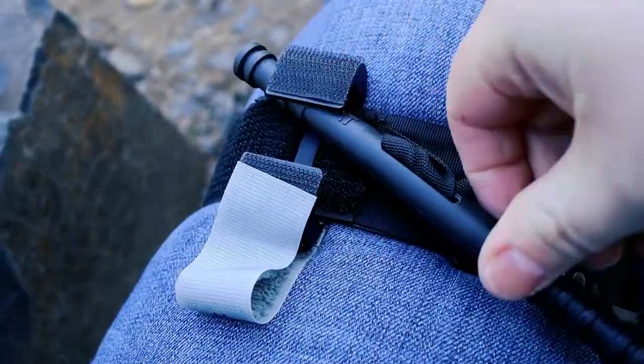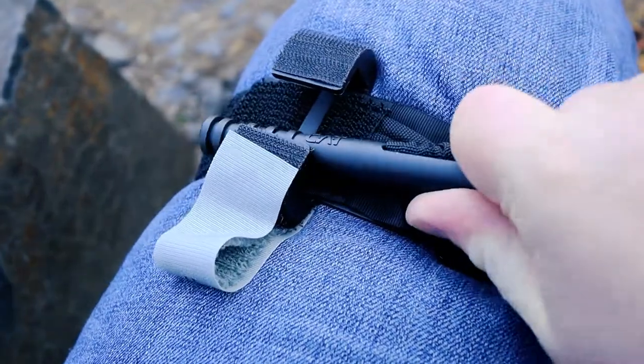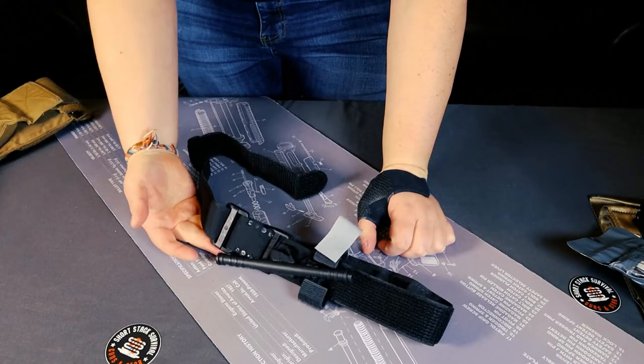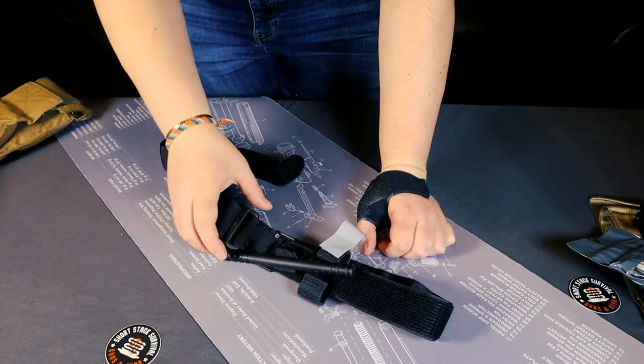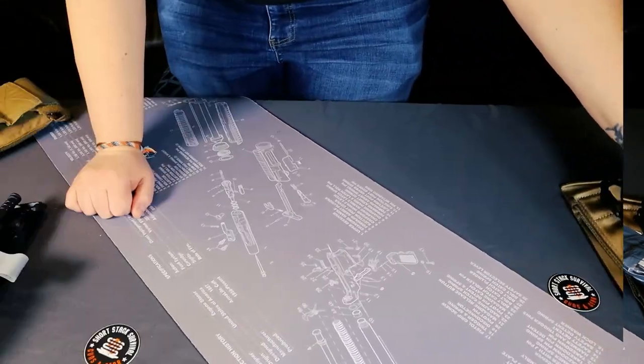Don't be afraid to try that on yourself. I wouldn't leave it on for a long time, but just getting in the practice of knowing how tight is tight enough to stop the blood flow to that extremity. This is the most common tourniquet nowadays — it's what most first responders have in their packs. I definitely would get familiar with applying the CAT tourniquet.